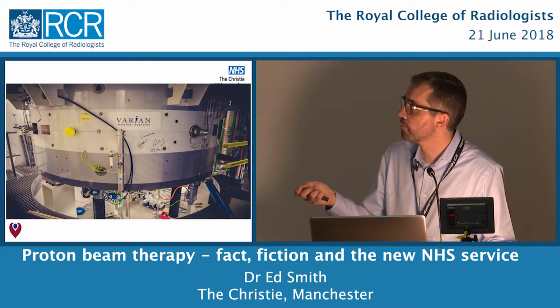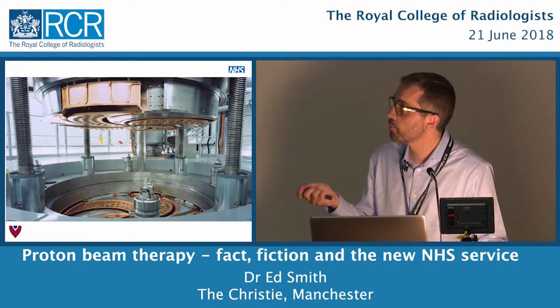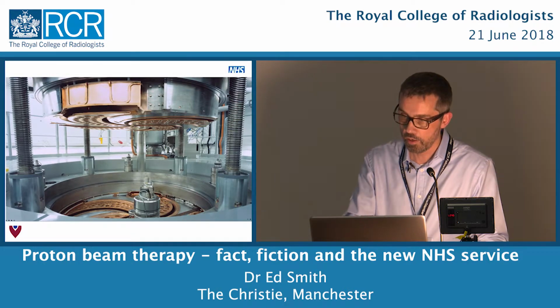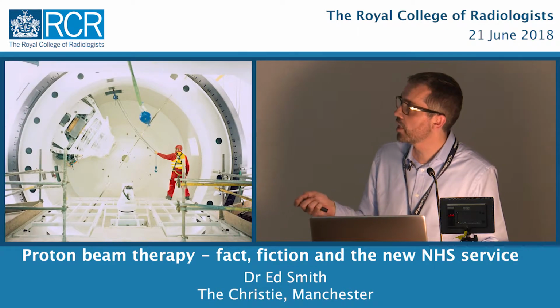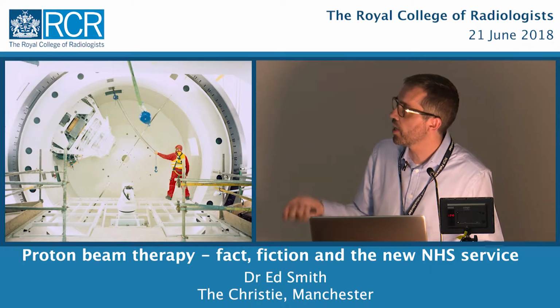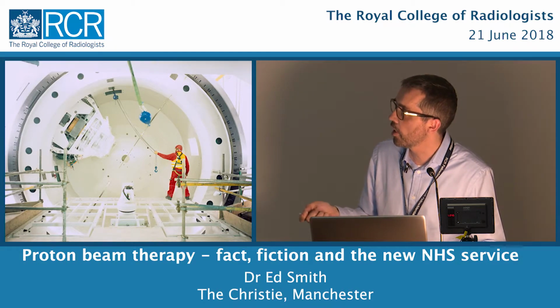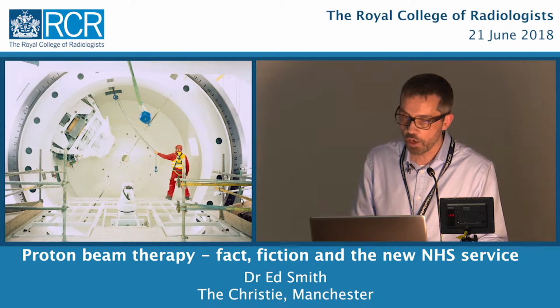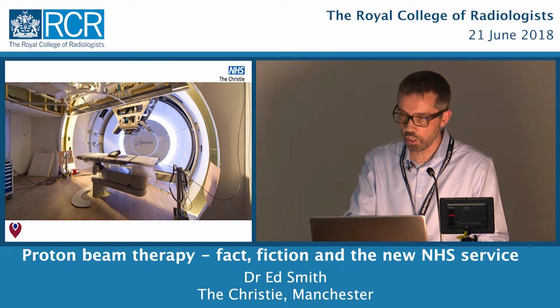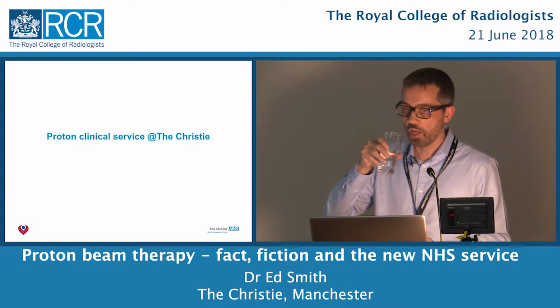Our cyclotron, Emmeline, this is her in situ. And this is her opened up because I mentioned D plates before and where the protons spin around, and this just lets you look inside her. The gantries are also taking shape. So you know, this is 3 floors. We're having to put a floor in, and the couch there for the patient to lie on. And again, that's really come on greatly, and we're now just putting the finishing touches to those rooms. So what about the clinical service at the Christie?